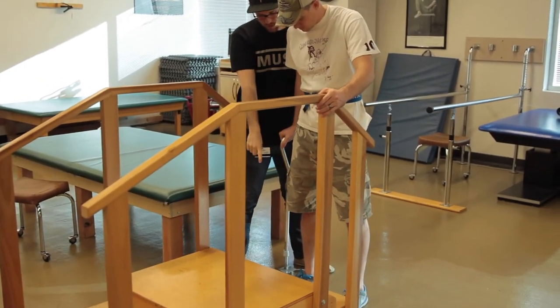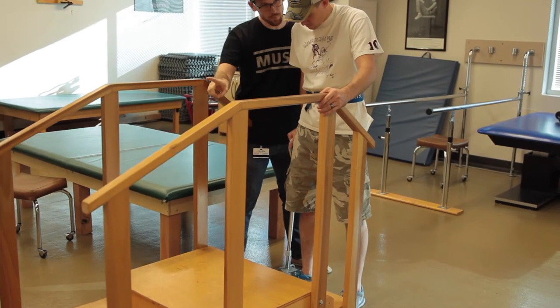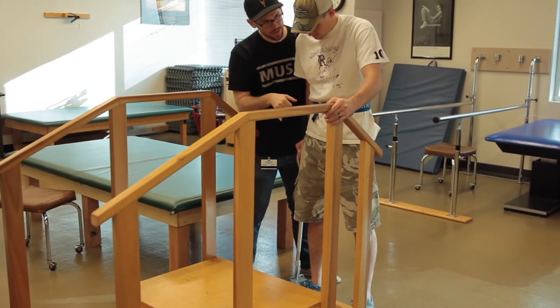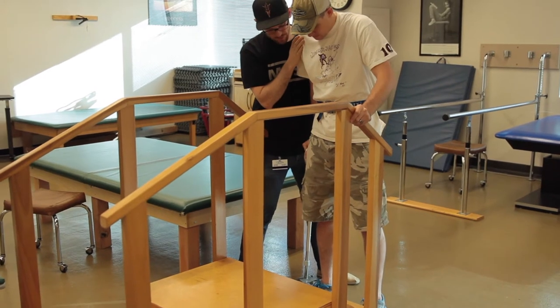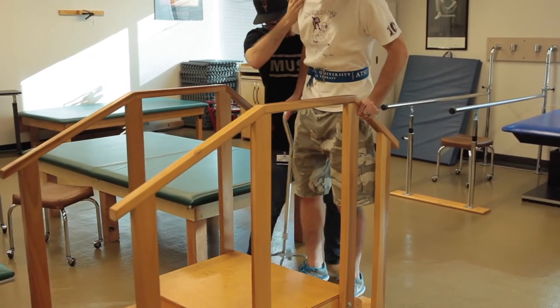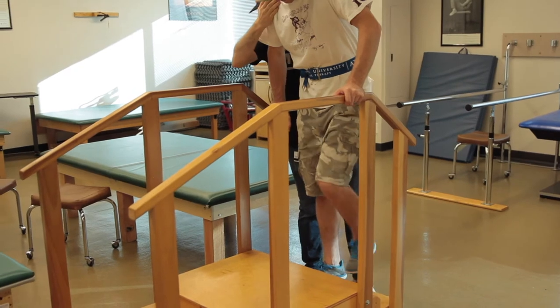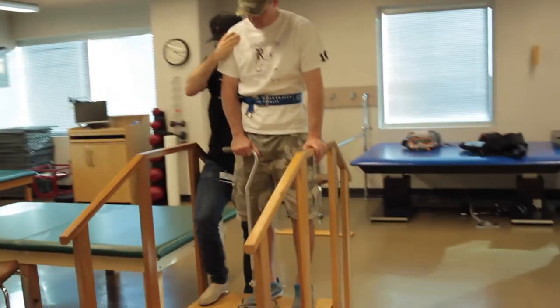And when we're coming up here, you can turn the cane sideways. On the way up, I want you to step with your strong leg. So that's with your left leg, followed by your right leg, and then the cane. And I'll be right here the whole time. So up with the left, and then bring that right, followed by that. Yeah, and you can do it sideways. There you go. And up with the left. Good. Now I'm gonna scooch forward here.